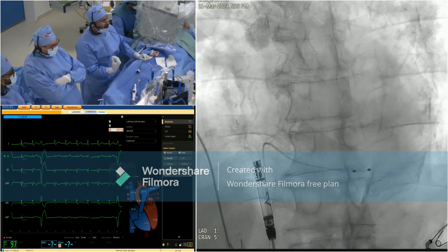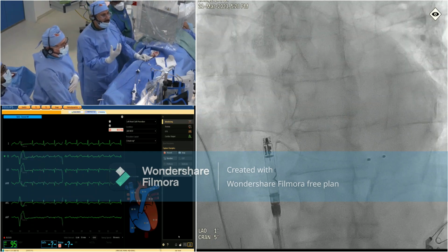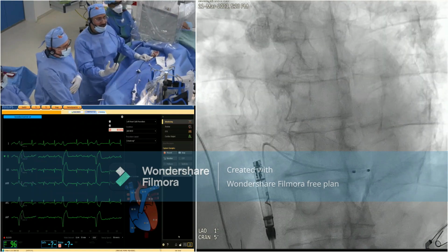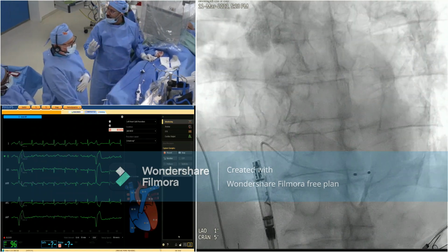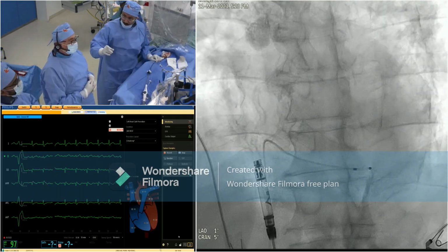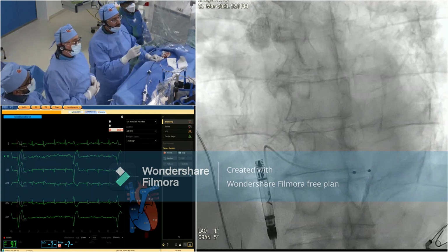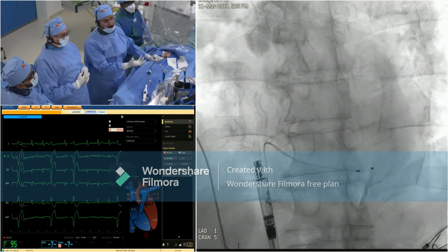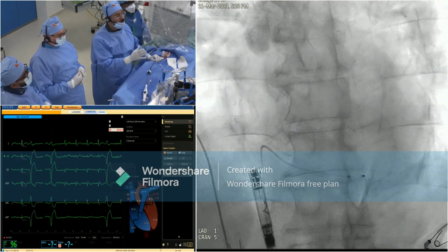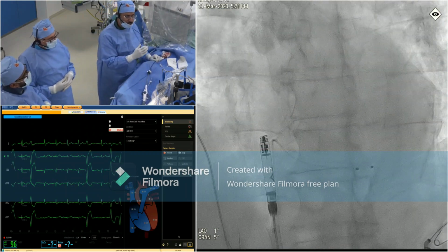We unsheath it so it will be active, because it gets activated by exposure to the blood pool. Once it's in contact with the blood, you have to ask the technician who is helping you, and sorry I forgot to introduce the whole team, but I think by now you know all of them, but we have extra help from Abbott, we have Fadwa and Rory from Abbott as well. You have to contact them and ask them to activate the device, which is automatic, but they have to stand on the programmer to make sure it will be active. Once it's active, you have to cover it again to ensure safety.